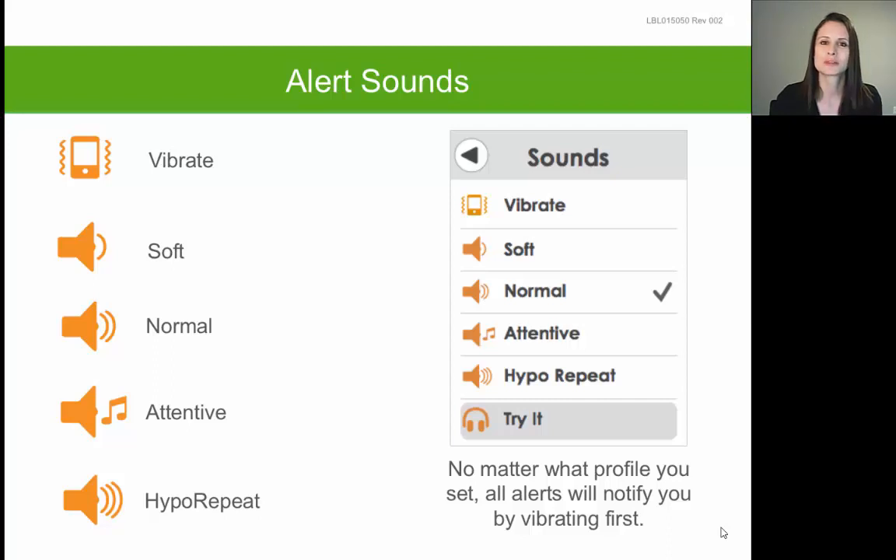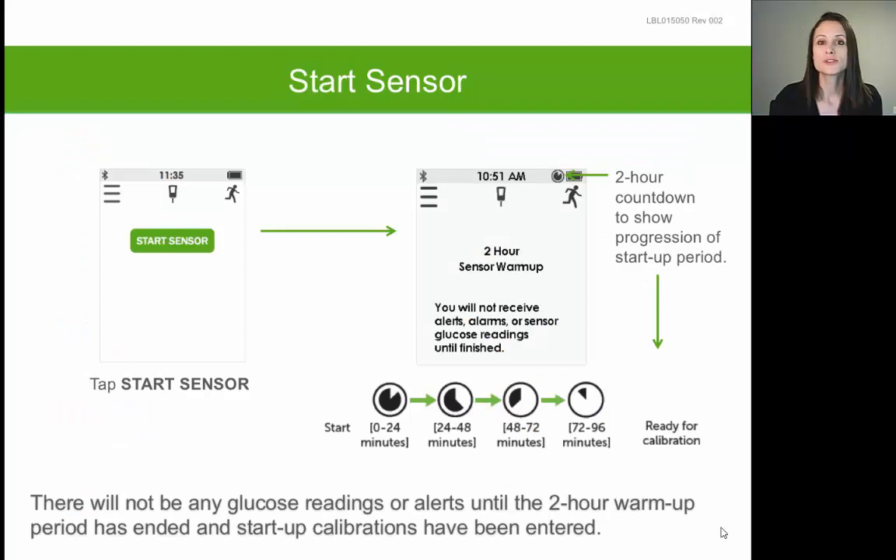To pick the sound you want, simply tap on it to create a check mark next to it. You can then tap Try It to sample that sound. To clear or silence an alert on your receiver, tap the word OK that displays on the screen during a high or low alert. It's important to note that the very first alert you get for a high or low glucose will always be a vibration only, regardless of what sound you select — it's only if you miss that vibration and don't clear the alert that it will result in the sound you've selected.